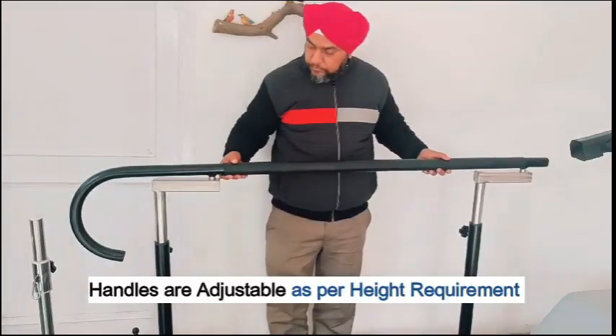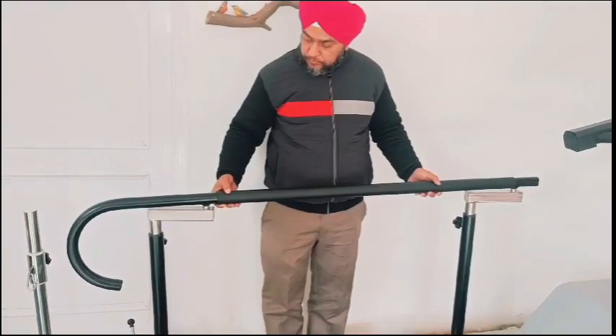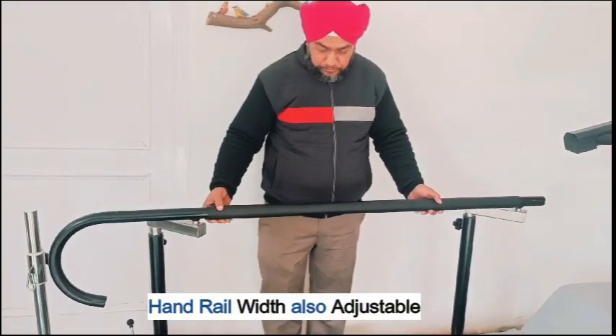Handles are adjustable as per the patient's height requirement. Handrail width is also adjustable to accommodate different users.